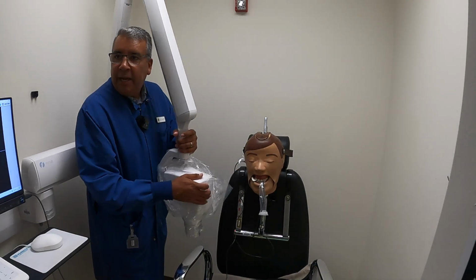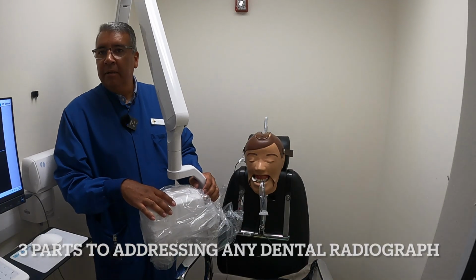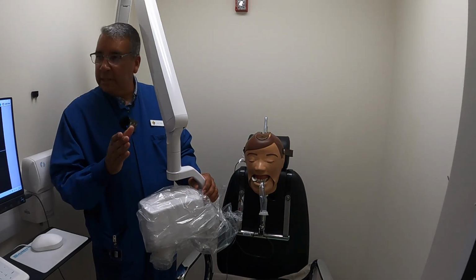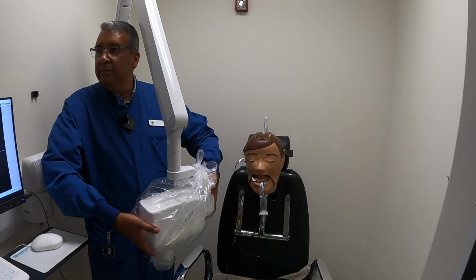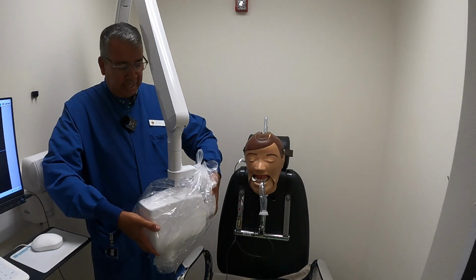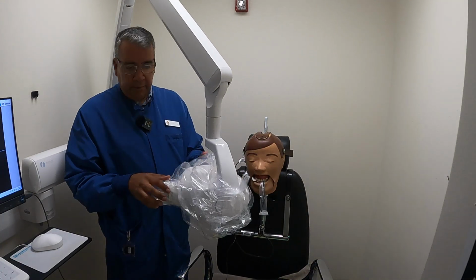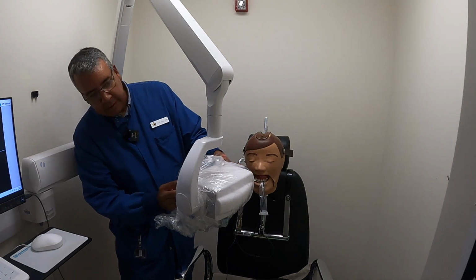What 3 things do we have to do? Parallel. Horizontal. And cover the film. Never changes. Always the same 3 things every single time. So what's my vertical? 0 degrees. I'm going to go to 0 degrees, reference the front. There it is, 0 degrees.